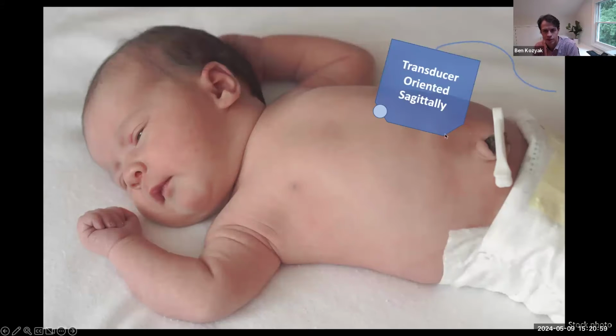So if you think about the orientation of the vascular anatomy, the umbilicus is midline, and the IVC and right atrium are slightly right of midline. So the imaging plane that captures most of the important structures is essentially sagittal, but rotated slightly counterclockwise. And then often sliding a bit to the patient's left and tilting the beam back slightly towards the patient's right brings the relevant anatomy into view. Sometimes, depending on the kid and their vascular anatomy, it's the opposite, sliding a bit to the right and angling and tilting back to the patient's left.